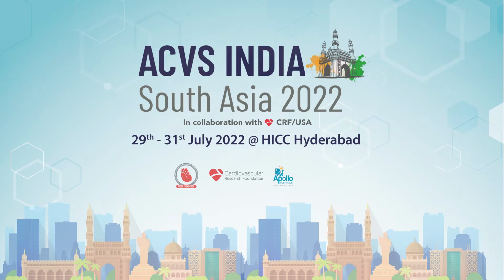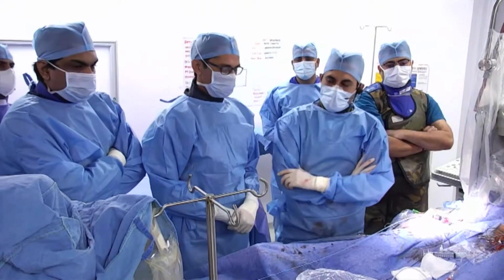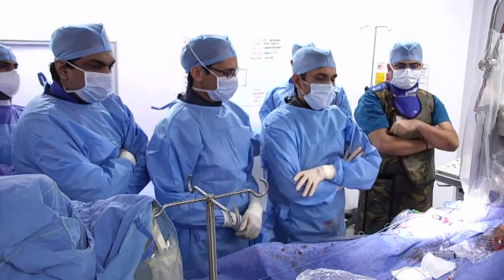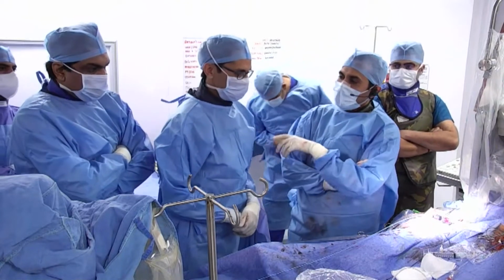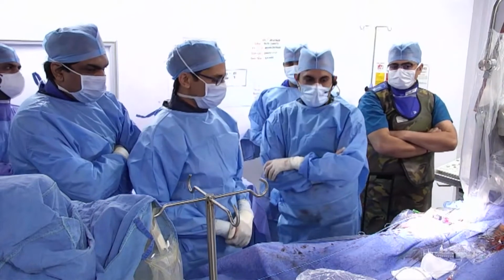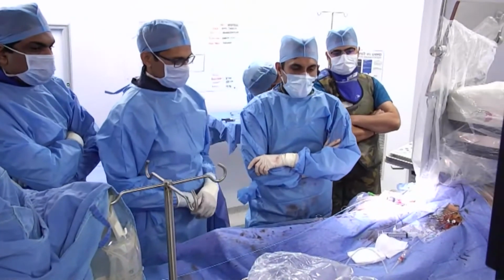So at the outset, I would like to introduce my team. On my right is Dr. Kailash. He is an interventional cardiologist. Dr. Govind Sharma, interventional cardiologist. Dr. Prashant Varshney, he's a cardiac anesthetist who takes care of all our TAVI, MitraClip, and all structural patients. We have our technician, Sandeep, and we have Boston as well as Edwards team. So our plan is to do a cerebral protection TAVI.